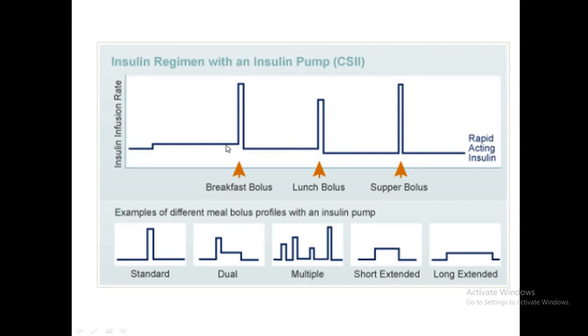Graphically, the basal rate is shown as a baseline. Standard boluses appear as a single peak. The dual bolus shows an initial dose followed by an extended release. There is also a short extended and long extended bolus depending on the food. The extended bolus does not peak but acts over a long time, particularly when fat delays carbohydrate absorption. Multiple boluses can be given when snacking between meals.